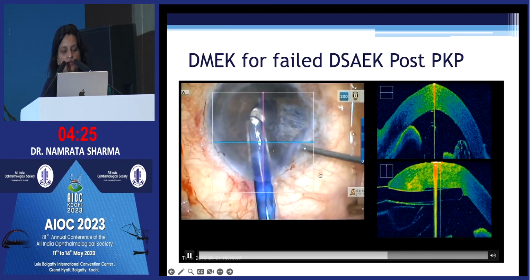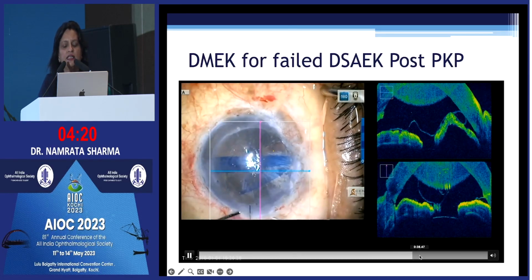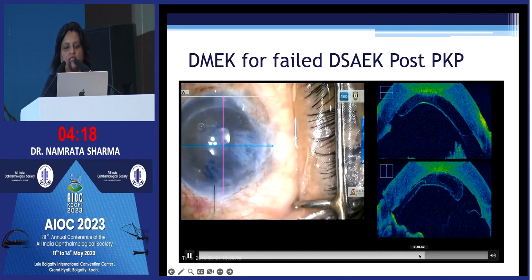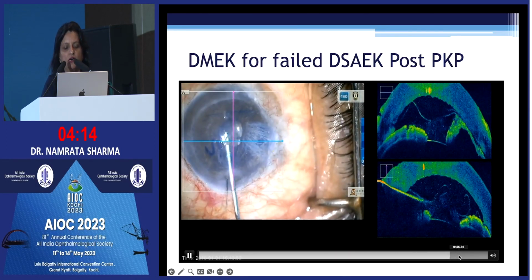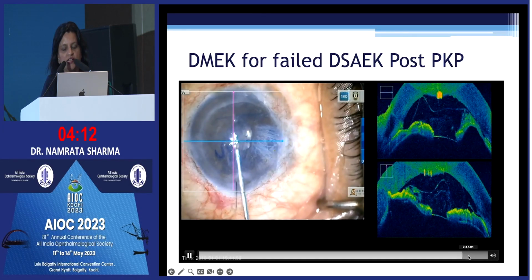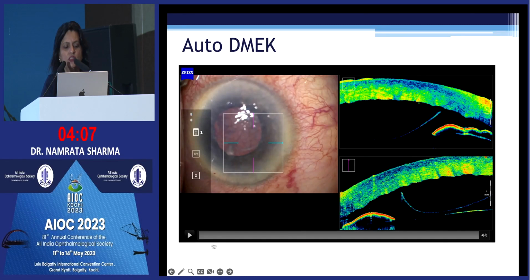Otherwise also it can be seen, it becomes a little easier because then you just don't have to do anything except tap, tap, tap and put the air bubble. Of course, the correct S is also staring at you, so you know that you are absolutely in the correct direction.